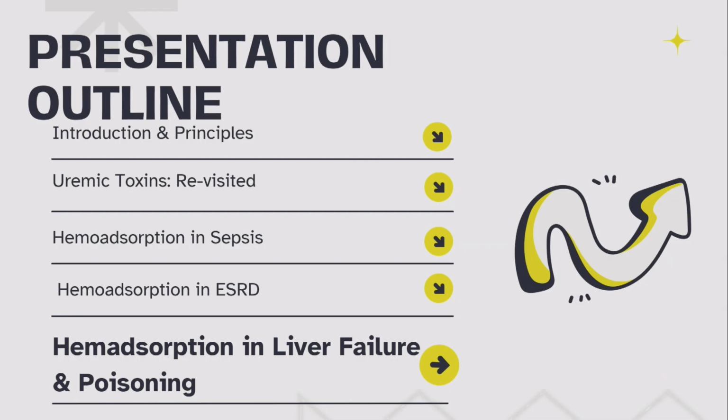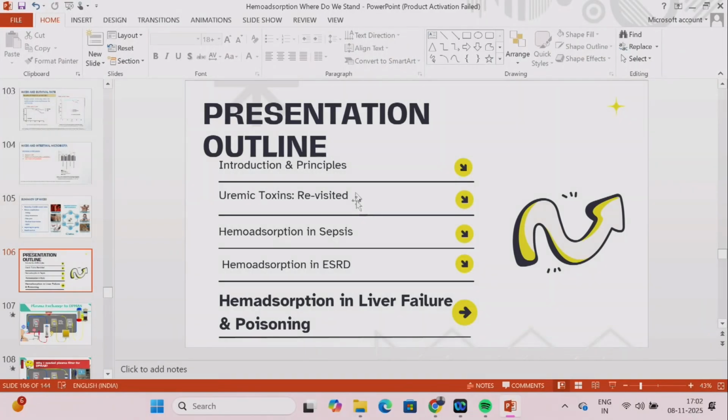I have a practical question. When we couple hemadsorption or any sorbent with the dialyzer, should we connect it pre or post dialyzer? Post. Post dialyzer. And it can take blood into it.